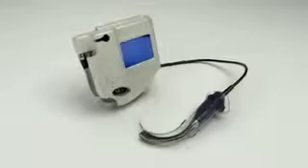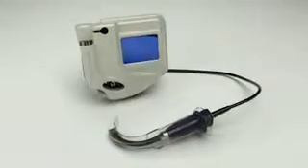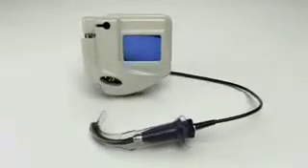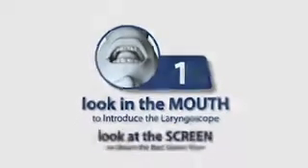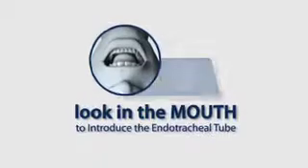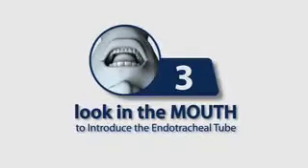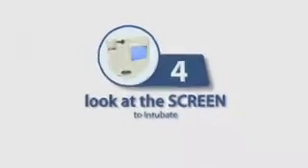A four-step technique to Glidescope videolaryngoscopy combines direct vision of the patient with views on the Glidescope video monitor. Start by looking in the mouth to introduce the laryngoscope, at the screen to obtain the best glottic view, back in the mouth to introduce the endotracheal tube, and finally, at the screen to intubate.